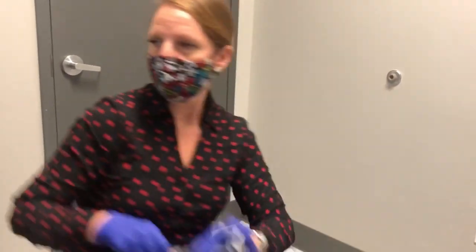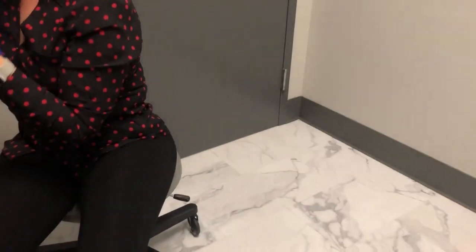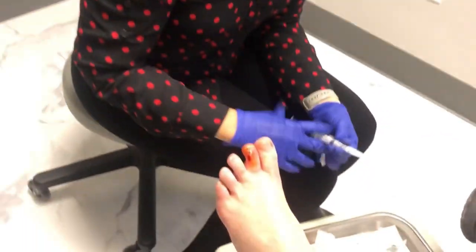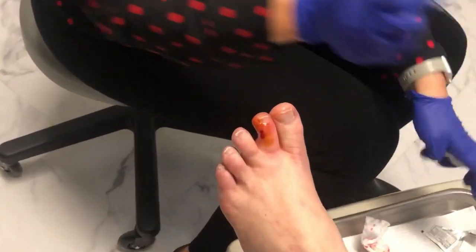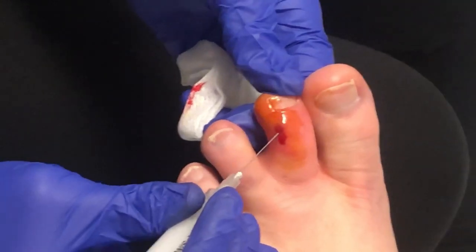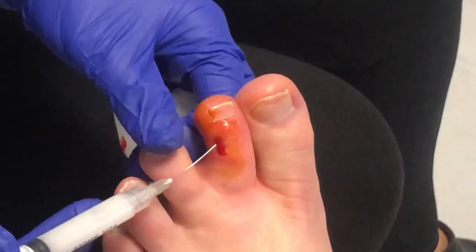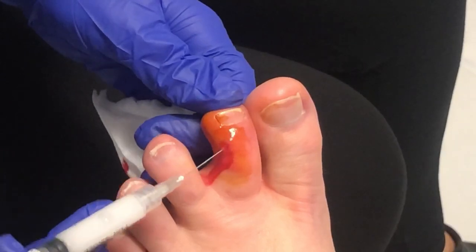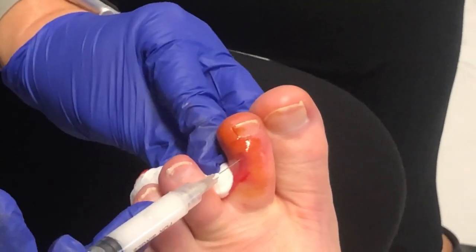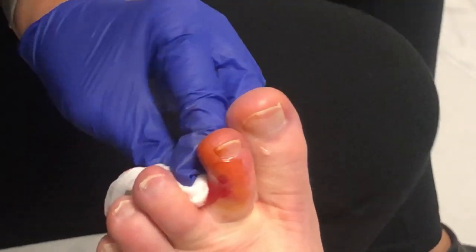Are you allergic to any steroid medicines? No? Perfect. It's already numb so I won't even have to spray any cold spray. We'll just put a little bit in there right through that hole and into that joint. It should feel significantly better in a day or so. There we go — it doesn't take a lot.